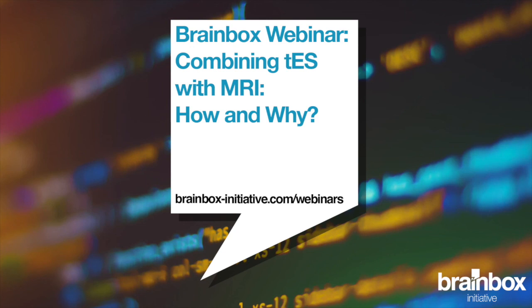Sorry, yes. But we at Brainbox have taken that knowledge and experience from Oxford, and we've helped other labs replicate the same kind of solution at 7T as well as 3T. So with the help of Charlie's group, we've been able to help other groups achieve the same thing. So the answer you gave is still true and valid. I would just add a bit of caution for anybody who might have the Neurocon kit in particular: you would need the non-standard version of it to be able to use it directly at 7T.